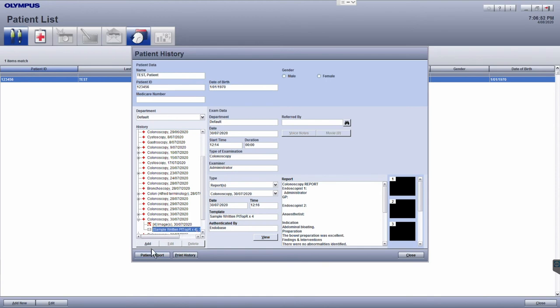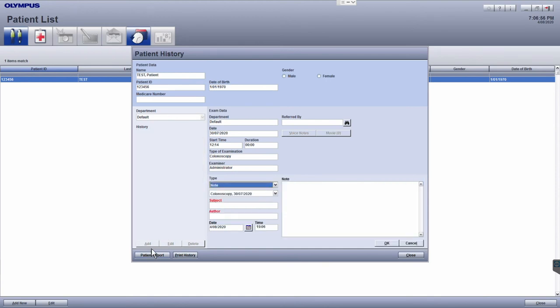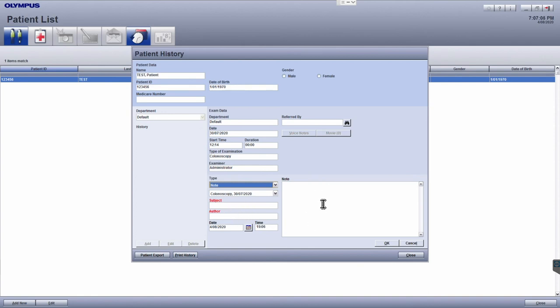Additional notes can be added to the examination by clicking the add button. The subject and author of the notes are mandatory fields, so this will need to be filled out to create the note.